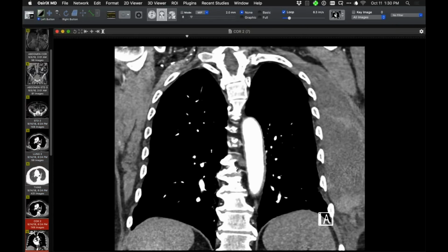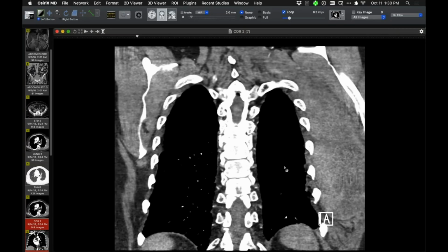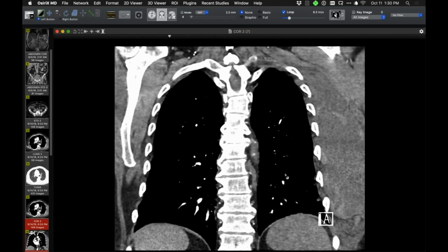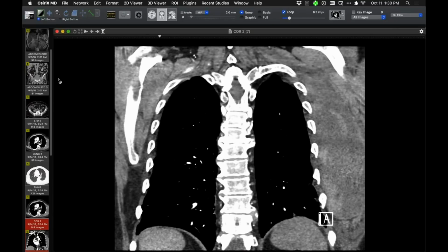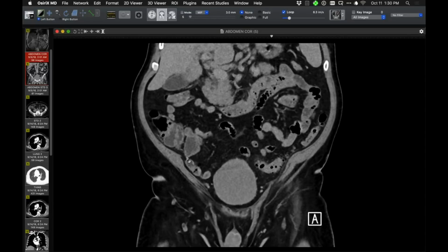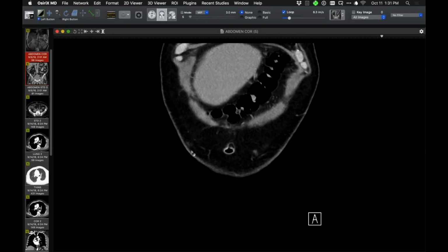So there is a huge chest wall pathology, left chest wall, variable in attenuation, some areas of relatively low, some areas of relatively high attenuation. Initially, it was suggested that that could be a tumor, a sarcoma perhaps, but we do have imaging from just a few days before. And of course, on that imaging, that's not there. So this developed in just a few days between the 5th and the 14th of September. So it certainly cannot be a tumor.